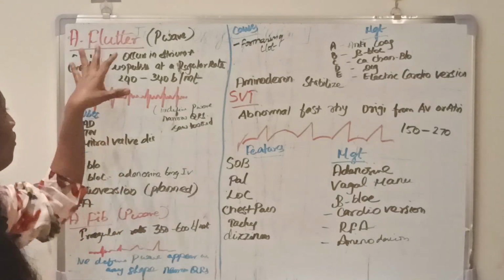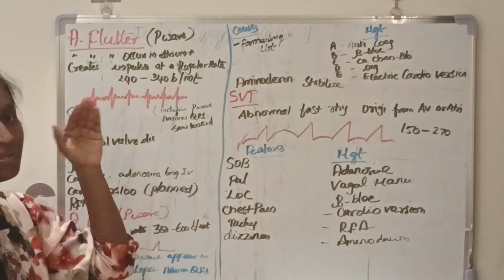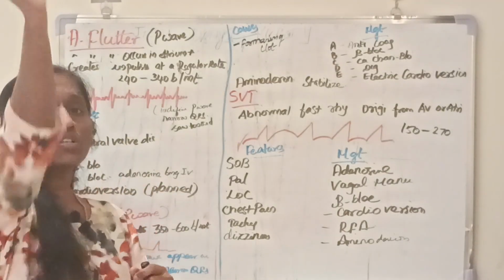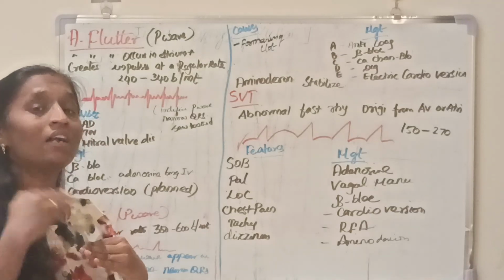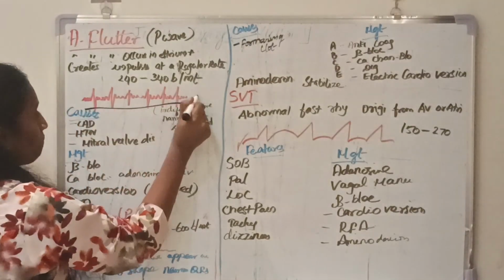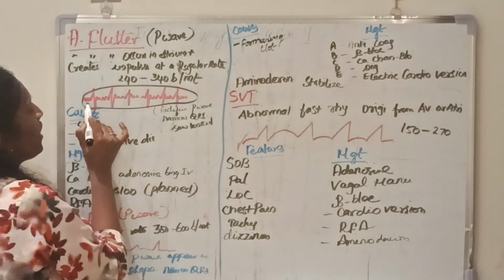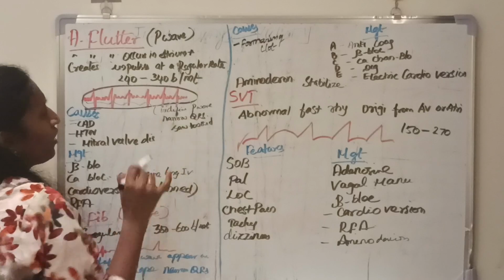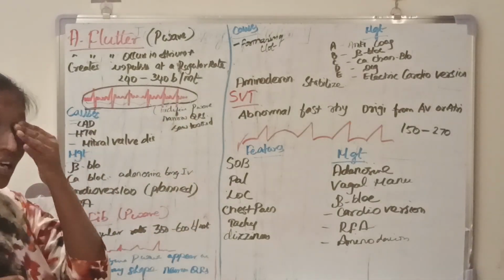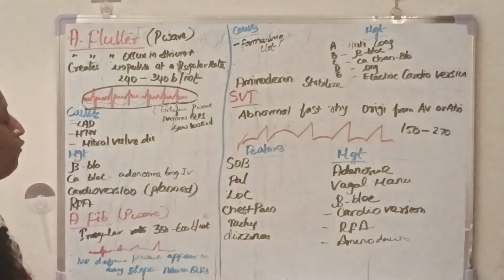Understand? Okay. So atrial flutter, atrial indicates the P wave. Atrial flutter occurs in the atrium and creates impulses at a regular rate. Here the P wave is unidentifiable. We cannot make out the P wave. You can see the ECG of atrial flutter. The QRS complex is narrow and at a regular interval. It is like a sawtooth appearance of the P wave present in atrial flutter.